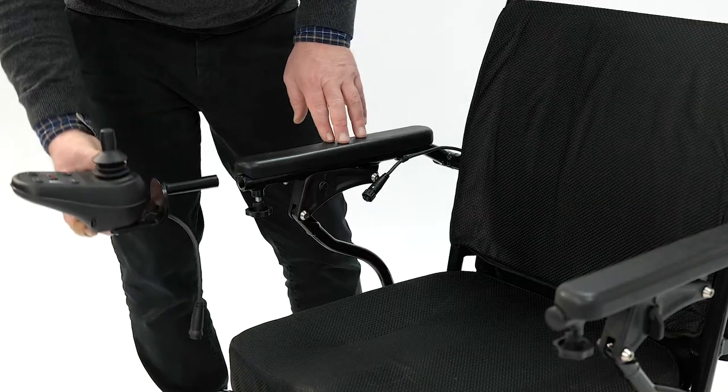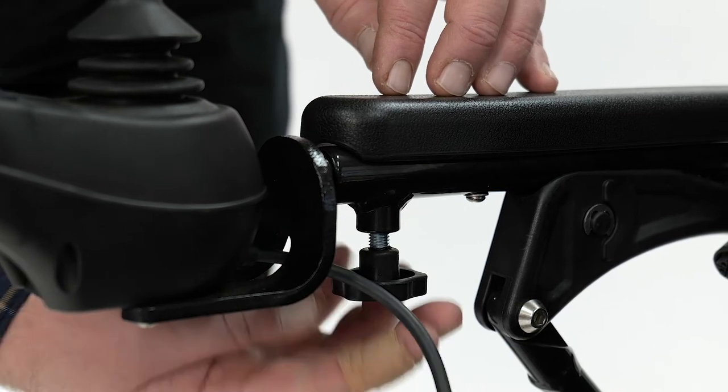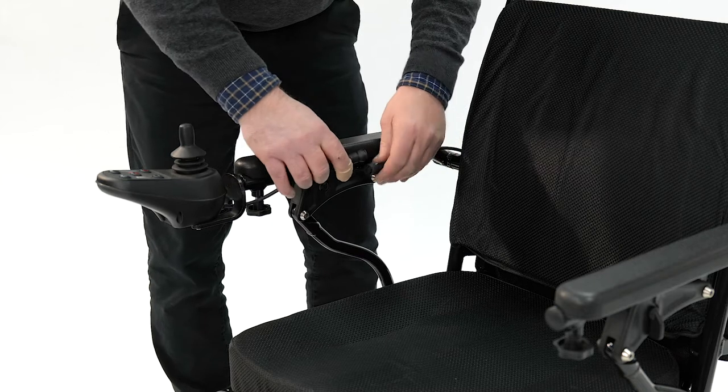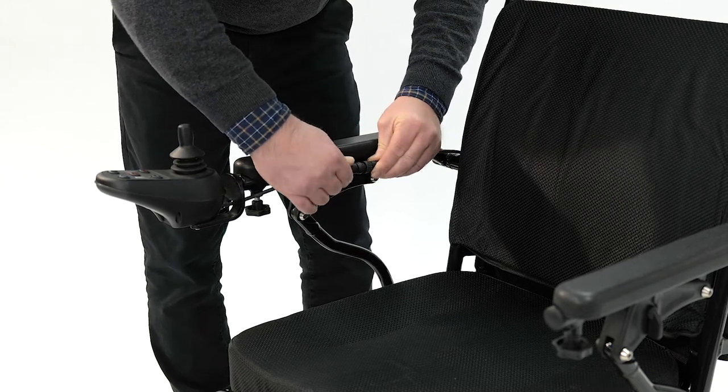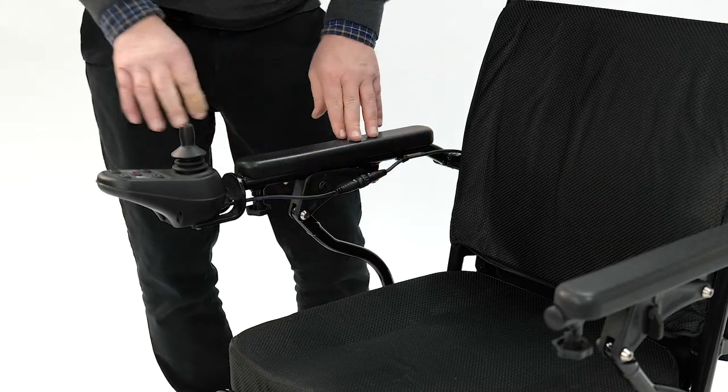The controller fits just underneath the armrest and fastens up using the knob underneath, then connect the wires together. The controller can be fitted on either side. Attendant control is also available.